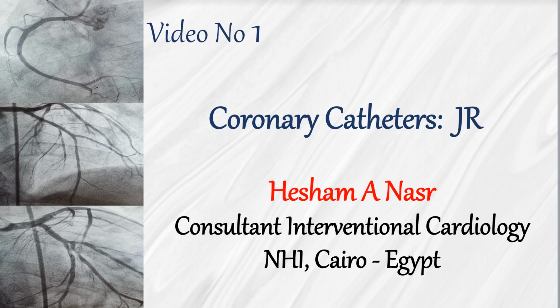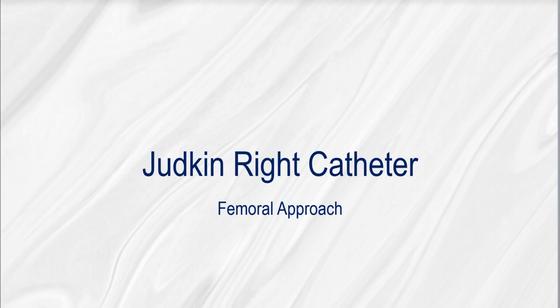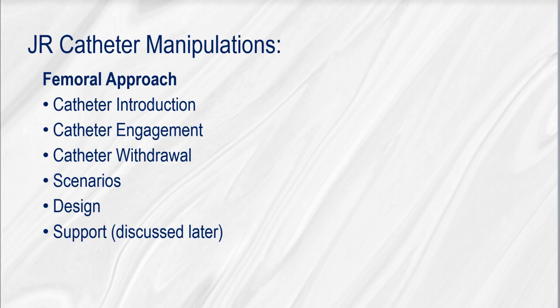We will talk about coronary catheters, Judkins Right. We will discuss Judkins Right catheter manipulations, femoral approach, regarding catheter introduction, engagement, withdrawal, different scenarios, and design. Support will be discussed later.